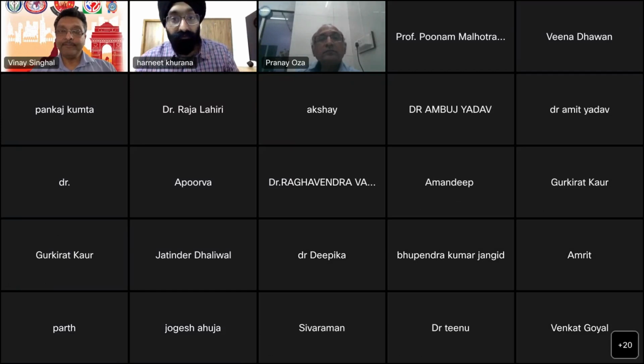We have a question in chat: can you do MRI if a patient is on ECMO? I don't think so, as far as I know, because maybe one is all these wires are there. Your ECMO console is not MR compatible. So I don't think that in the present scenario we can do MRI on our ECMO.